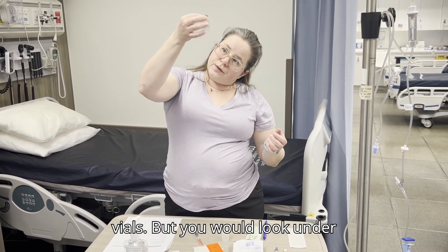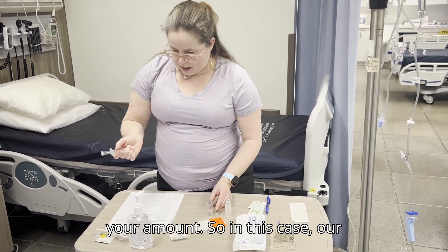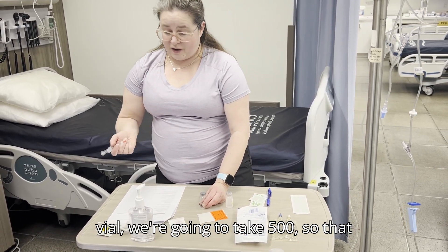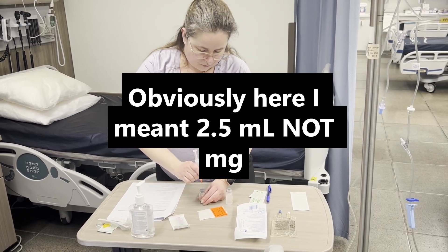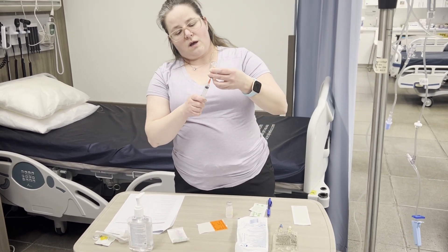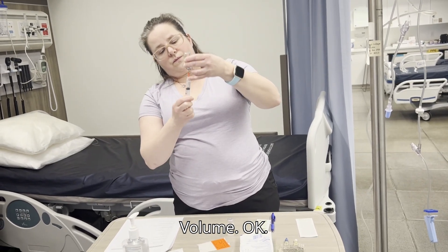Normally your vial would be fully labeled, and you would look under the label to confirm the powder is dissolved. In this case we have 1000 milligrams in the vial and we're taking 500 milligrams, so that would be 2.5 mils. You put the needle in, inject the air, invert the vial, and bring out your volume.